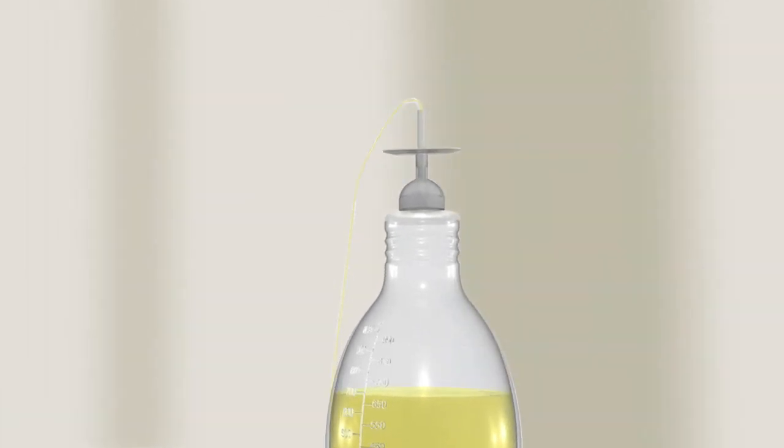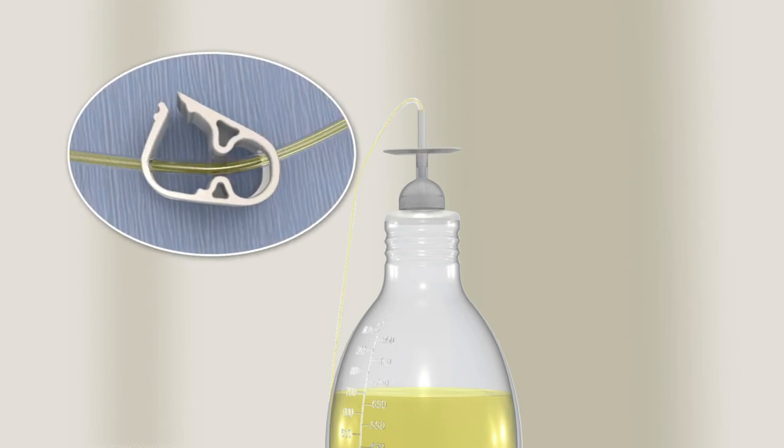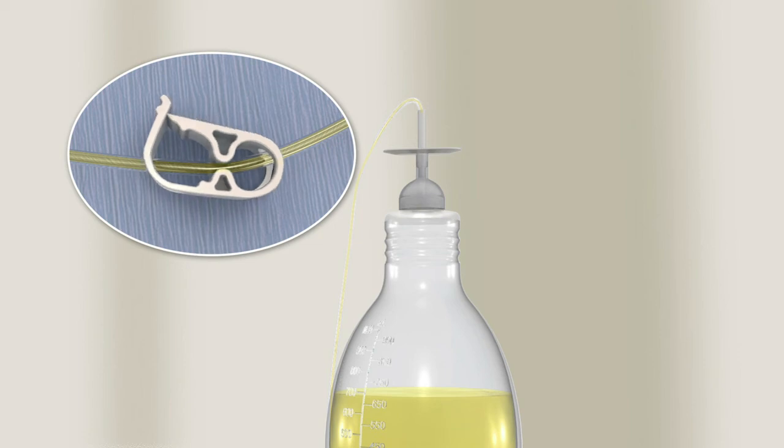To empty the bottle, push down on the white T plunger and move it in a circle to increase the size of the opening in the foil seal. Release the pinch clamp on the drainage line to release any vacuum left in the bottle. Then, re-clamp the drainage line completely.